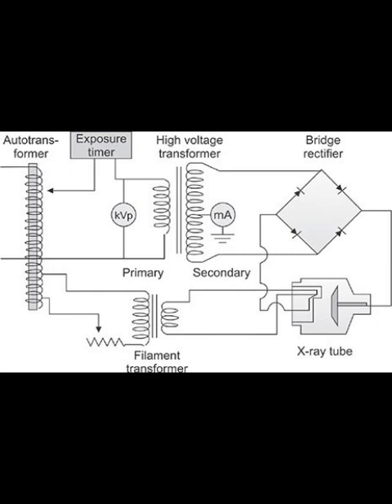So the challenge then becomes, like you said, how do we get the exact voltage needed? Because different parts of the system need different things, right? You need low voltage for one part, massive voltage for another. Yeah, you've hit on something crucial there, that need for precision and different power levels, and it leads directly into how that voltage is manipulated because, like you said, we need different settings for different scans. So we generally have two main types of transformers in an X-ray system. First, the big one, the step-up transformer.